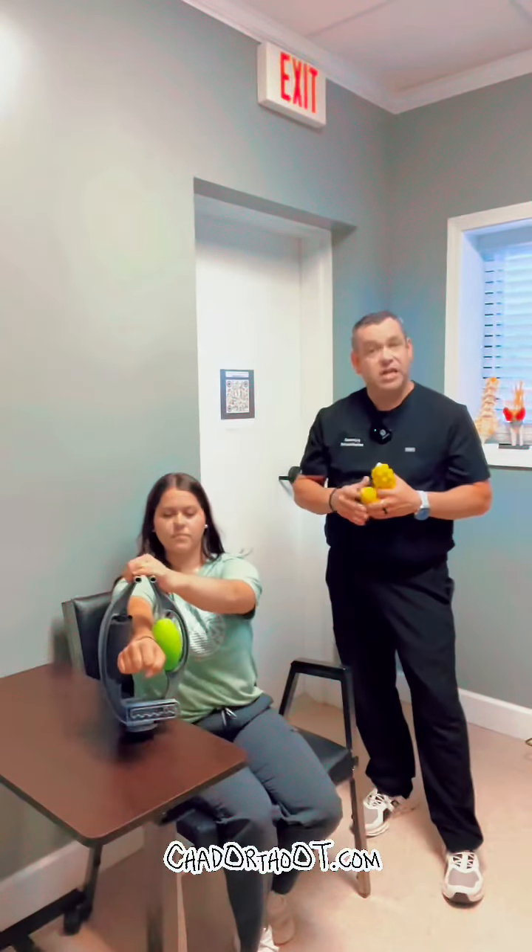It's an easy way to do that at home, especially if you're having nerve pain or things like that. You can try this and see if you get some relief with it. Super cool and really pretty inexpensive. Thank you so much again to Rollflex for sending me this product to review — I definitely recommend it. Thanks so much.